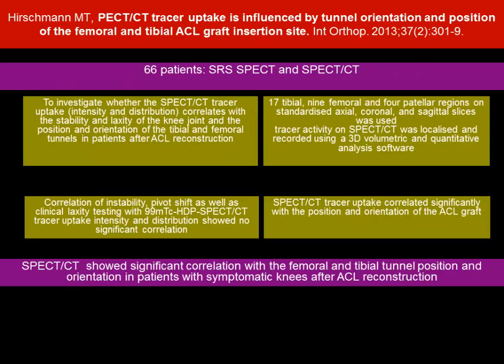Another example, this is from Switzerland, one of my orthopedic friends. They looked at the role of SPECT CT in assessment of tunnel orientation. In fact, they are quite good. This is only one center. They have their own device and the scorings, and they do it quite well, because in the whole project there is an orthopedic surgeon involved, and the scans are reported along with the orthopedic surgeon.